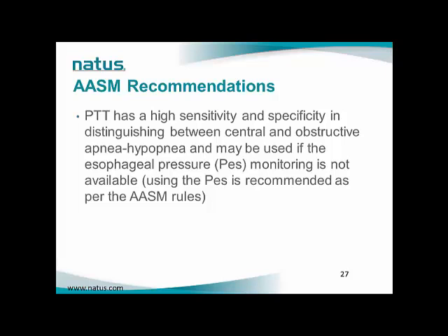As per AASM recommendations, PTT has a high sensitivity and specificity in distinguishing between central and obstructive apnea-hypopnea, and may be used if the esophageal pressure monitoring is not available.